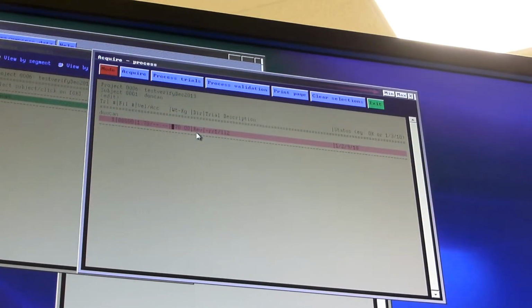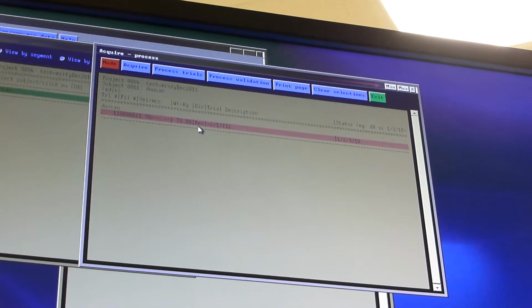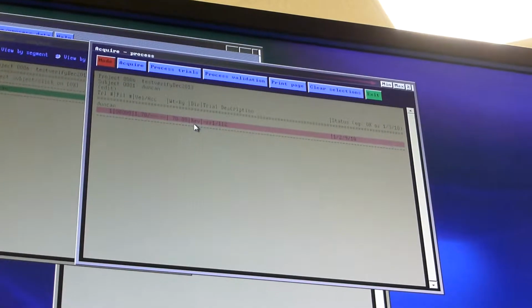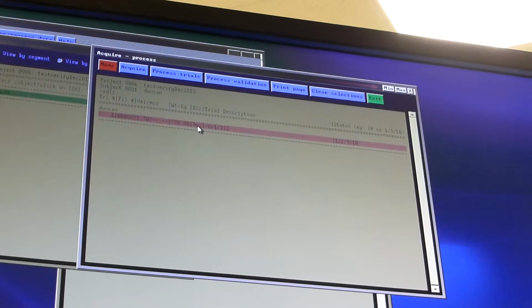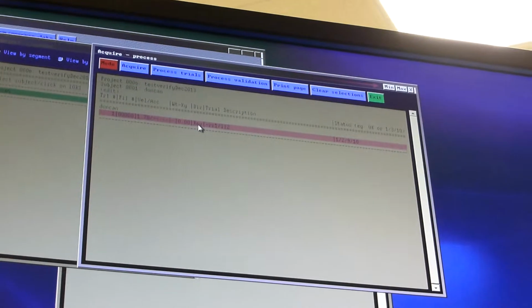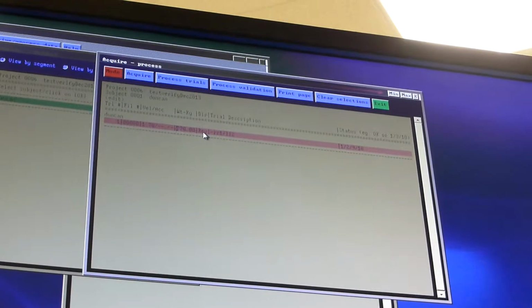Okay. It does that based on Y forces. In one case, the force starts out going positive, and in the other direction it goes negative. Whichever way it sees that starting out, that determines the direction. So if it says REV, does that mean you really stepped on plate 2 first? Because it reversed it. No, REV just means the dog walked in the opposite direction. But they would strike force plate 2 first. Right. So we'll find out with the practice.